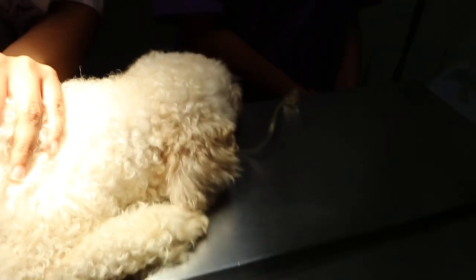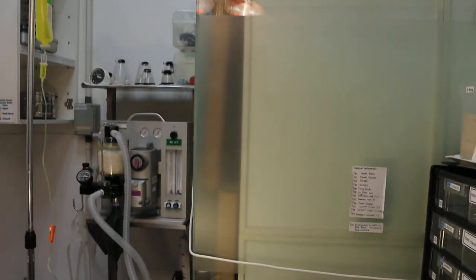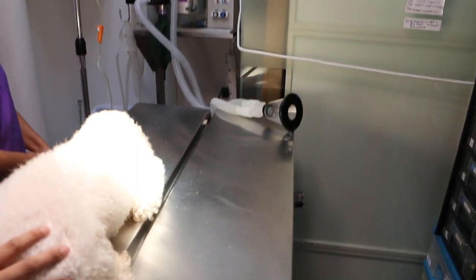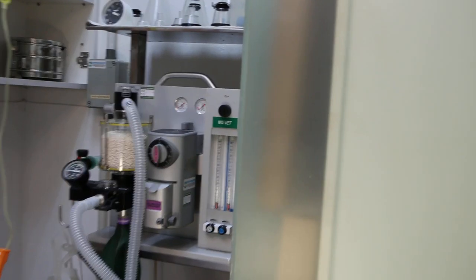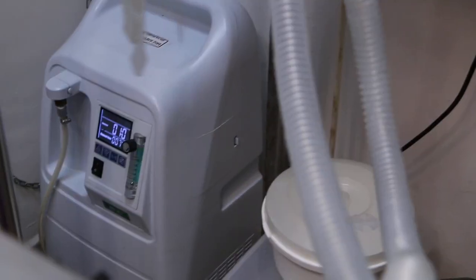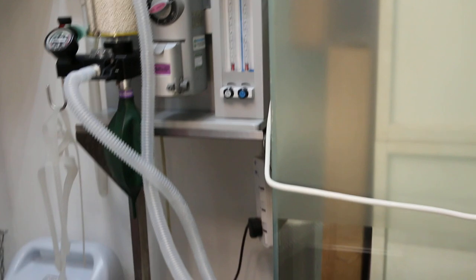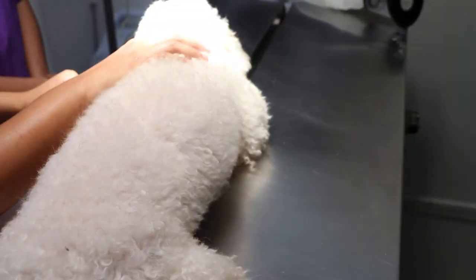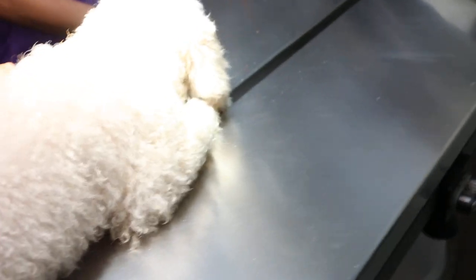This is just to show the operating room of Topaya Vets, for those dog owners who have no access to this place. This is the operating table, and there's an anaesthetic machine. We will start the gas at 5% first. There's an oxygen generator instead of using the cylinder — we use the oxygen generator, with the cylinder kept on standby. This will give the owner some idea of what happens to the dog when they bring it in for surgery. We are just showing the anaesthesia part only; the spaying of the dog will not be shown, as it is too bloody and gory.